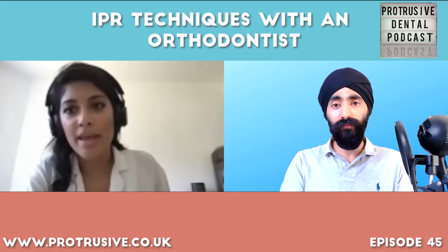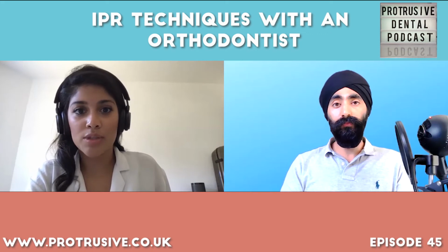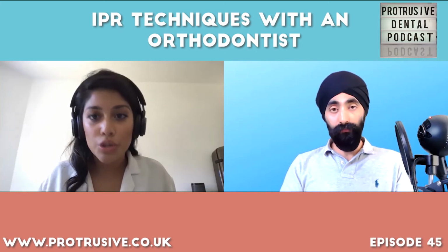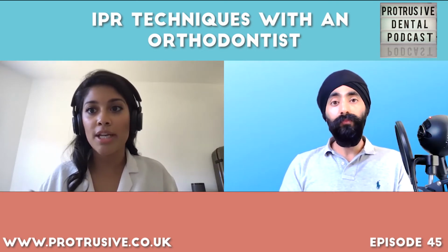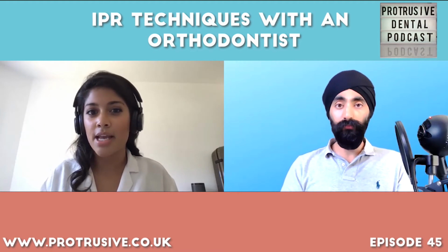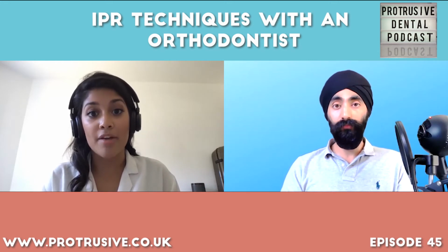I always think it's better to be conservative with your IPR. After you've taken away that enamel, you're not getting it back. And you also have to think about the aesthetics. What's it going to look like? If they're going to look like tombstones, it's not going to be nice for the patient. So I prefer not to do all my IPR in one go. I like to stage it, because teeth are continually moving and you need to forward think, where do my teeth want to go, and then do the IPR to facilitate and create space for them to move, if that makes sense. If you do it all at the beginning, you could lose space, and space is at a premium, especially with IPR, so you want to be really, really careful.